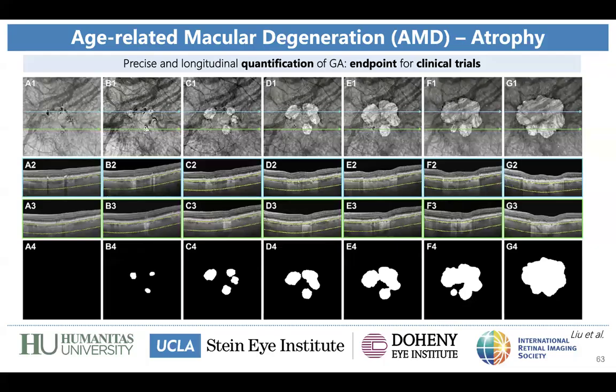The truth is that, in my humble experience, generalizations are never the answer. We should very carefully address the single case of the single patient, because the RPE status can vary very heterogeneously across different patients, even in the same patient at different time points.